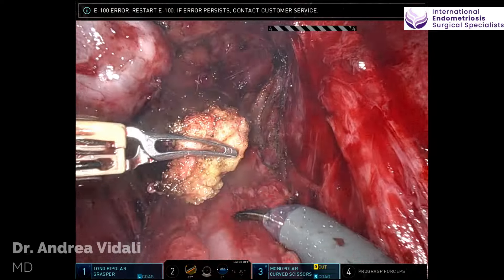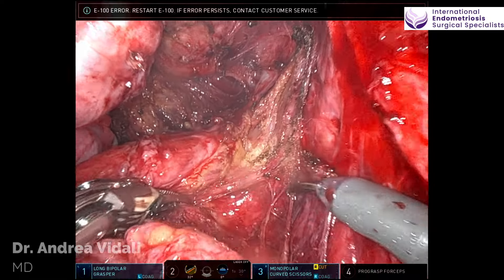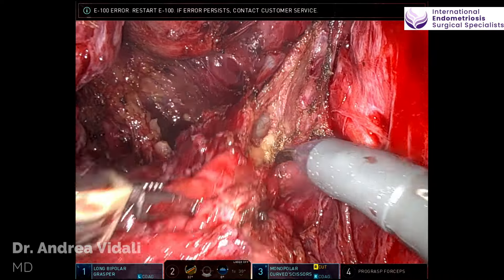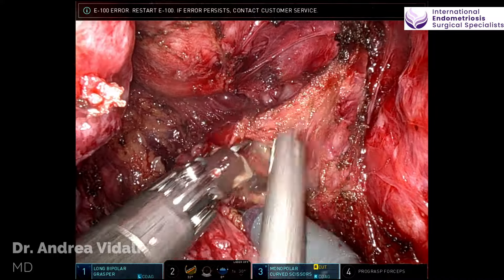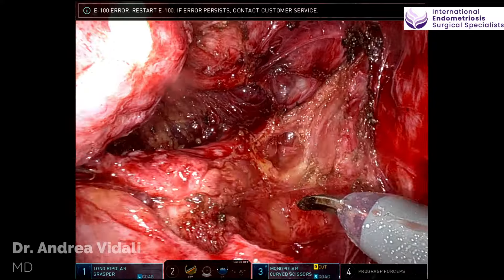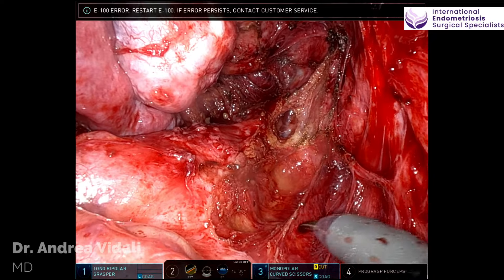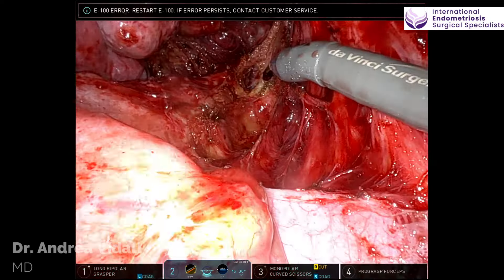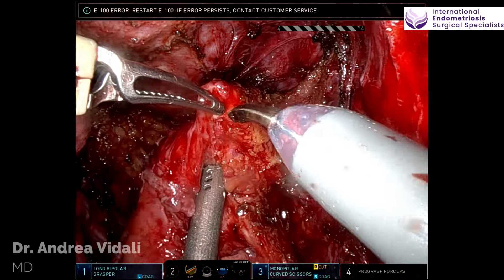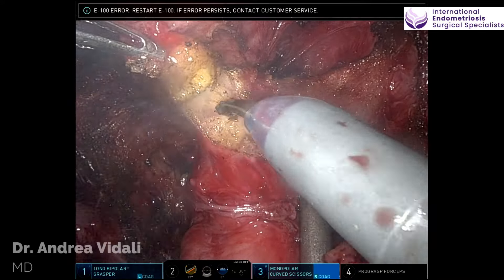I call this part of the procedure rectal degloving, because we're removing some of the serosal cover of the rectum without entering the rectum itself. Developing the right pararectal space, excising disease from the mesorectum. Although this robot doesn't have haptic features, visually and with the help of the assistant, we can definitely identify presence or absence of disease. Identifying the fascial layer that contains the nerve is very essential, proceeding with dissection in the right pararectal space.